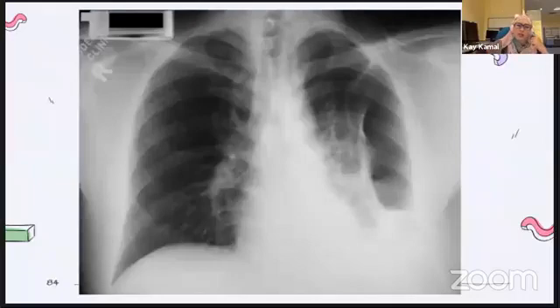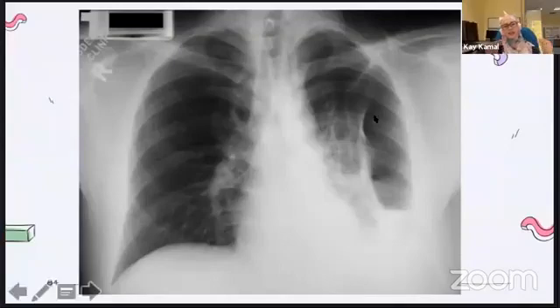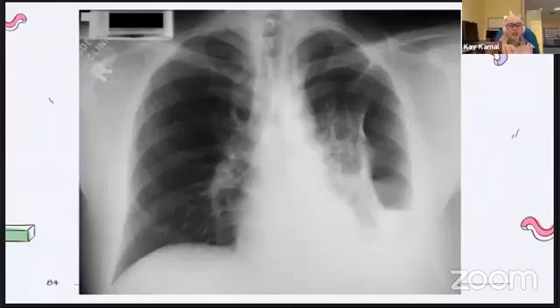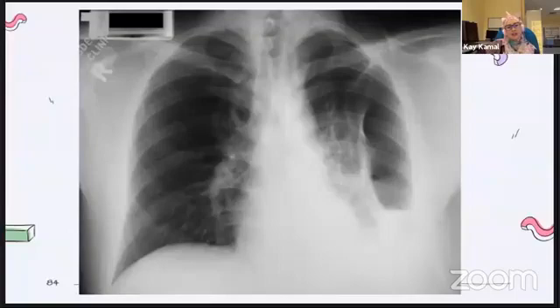Okay, I have to ask you first. Trapped lung is something I have never used. What is trapped lung like? The lung is trapped and unable to expand, like PTB near the bronchus. It will compress the bronchus and cause the lung parenchyma to collapse. It can be endobronchial PTB or a malignancy, a lung malignancy, from the outside that collapses the bronchus.